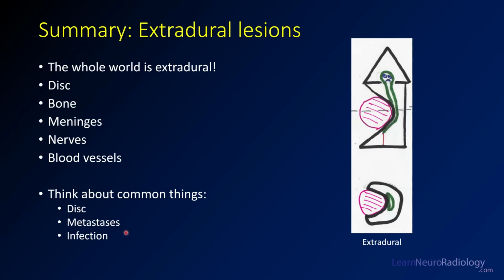So if you see a patient that has a fever, sepsis, or circulating bacteremia, think about whether you have infection like a discitis, osteomyelitis. Remember this classic appearance of extradural lesions.